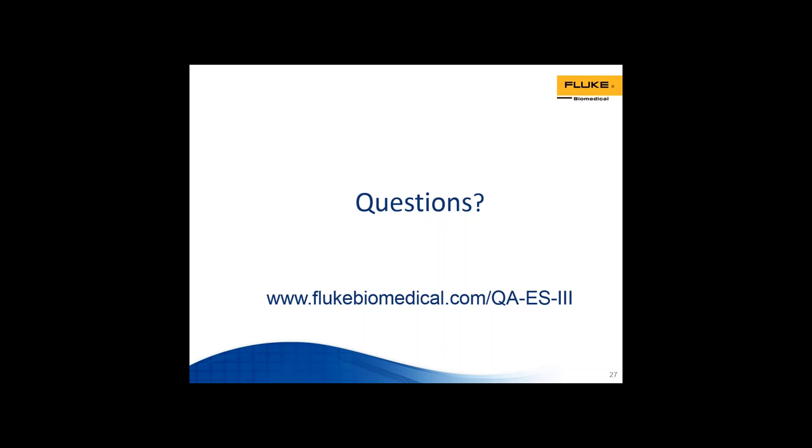Perfect, thank you. And this is probably in that video that you were talking about, but how do you transfer data from the QAES3 to a PC? The way to transfer the data from QAES3 to a PC is there's two ways. We provide a USB cable that you can essentially hook up to your PC, or it also has wireless built in to the unit, so if you have Bluetooth capability in your PC, you can transfer the data through the Bluetooth mechanism. Now the question is, how will the PC know?